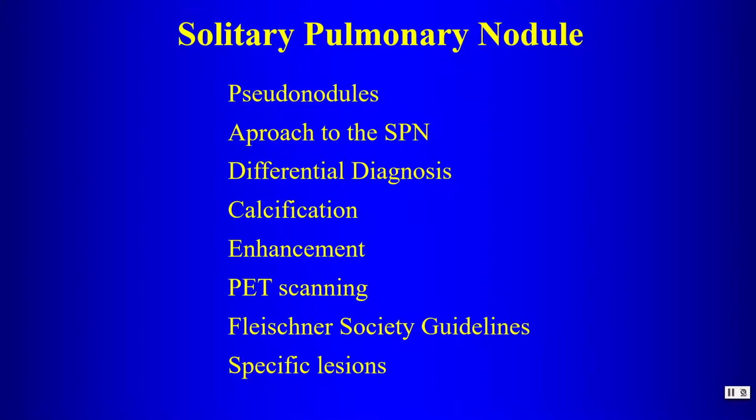Today we will be discussing the solitary pulmonary nodule, and these are some issues that we will discuss. We will discuss pseudonodules, the approach to the solitary pulmonary nodule, differential diagnosis, calcification, enhancement, PET scanning, a little bit about Fleischner Society guidelines and Lung-RADS, and we will also talk about some specific lesions.